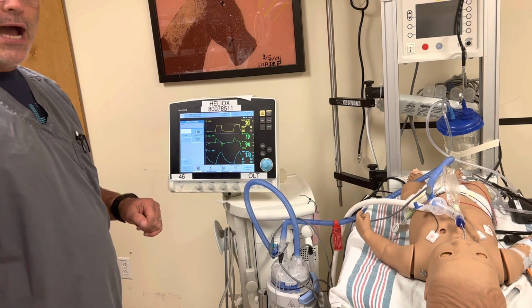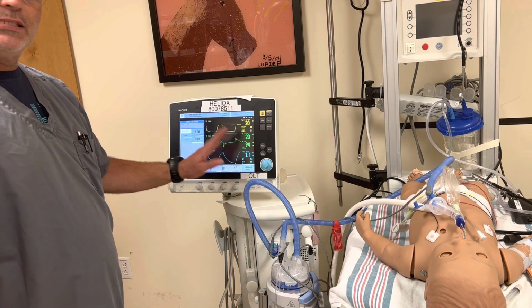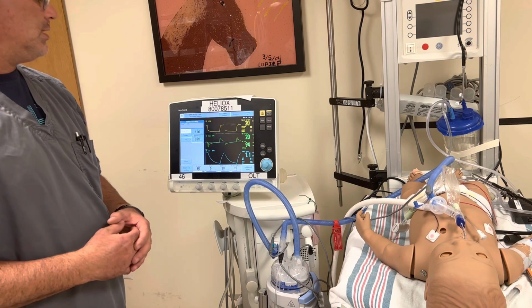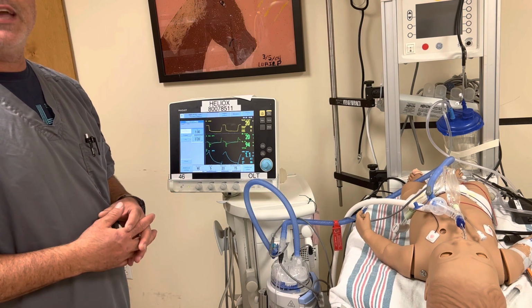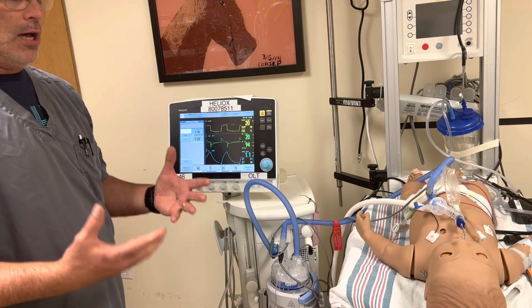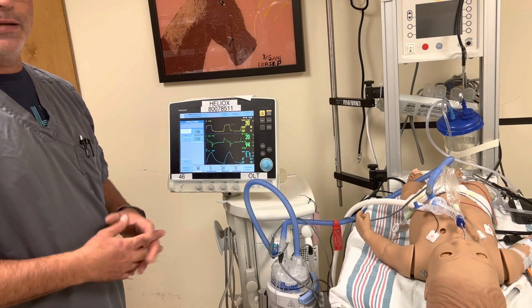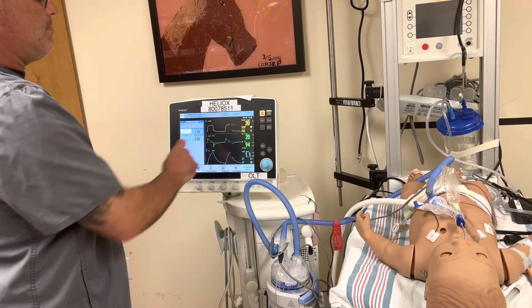If you don't fix the I time from the get-go, you're going to have lower volumes because of the I time being so short and the breath being cut off too soon, and you won't use the entire lung available to you. You'll basically be cramming whatever per kilo tidal volume you have into less than all of the available lung, and mostly it'll be the least compliant part of the lung that doesn't get to see any of the peak airway pressure, because that's the last part of the I time. That's the part of the lung that the I time reaches at the end. So we want this to be minimally zero flow.